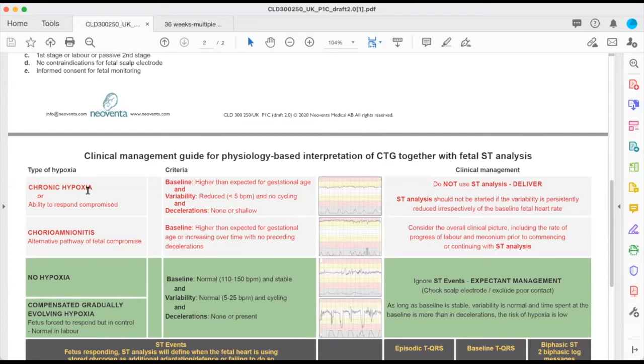Yeah. Remember, you have to start when the baby is at a steady, well state. You're comparing the baby to itself. It's not like when I'm going in with an MI and I'm doing an ECG, and you're comparing my ECG to what normally an ECG looks like. In which case, yes, you can put it on me for the first time when I'm already having a heart attack, and you can diagnose a heart attack.